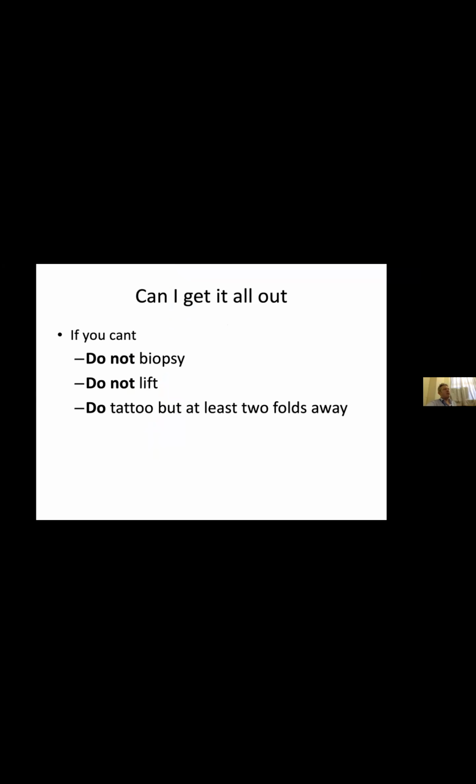If you decide you can't get it all out and you want to send this away, it is extremely important not to biopsy the lesion. The only time you want to biopsy a lesion is if you think it's cancer. You never want to biopsy a polyp. We have an absolute epidemic of people biopsying polyps in South Africa, and I'm sure it's around the world. You need to remove polyps. They are precancerous lesions. They must be removed in their entirety. Biopsying them just tells you it's a precancerous lesion that needs to be removed in its entirety. But what it also does is make it much more difficult to remove later on.